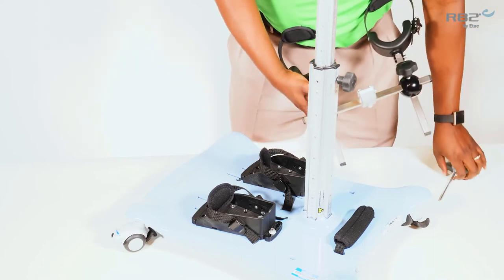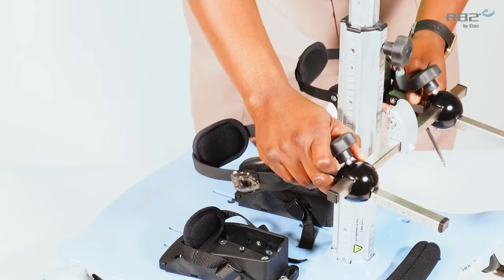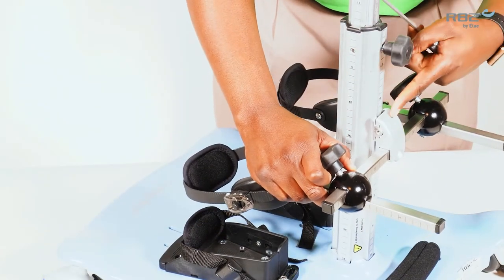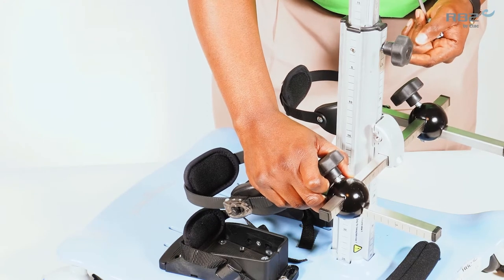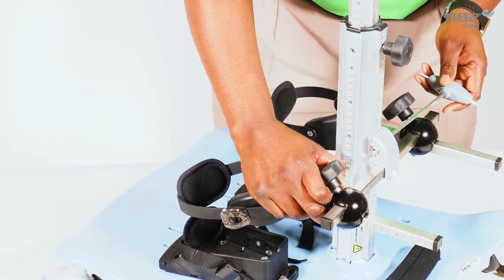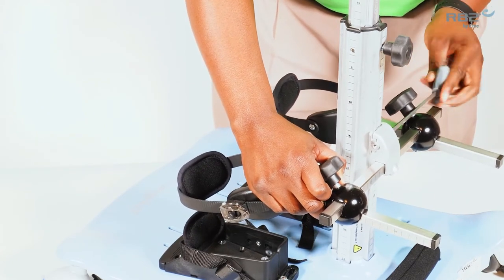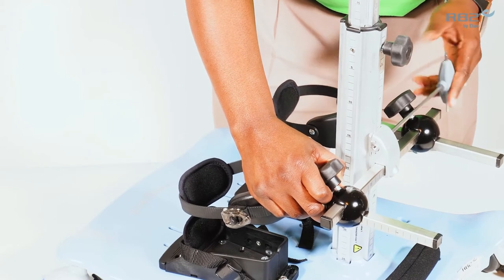To mount the knee support, align the universal mounting bracket onto the rear of the height adjustable column. Once you reach your desired height, tighten the bracket onto the column.